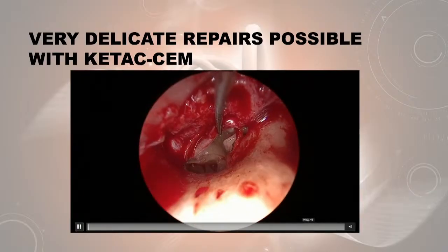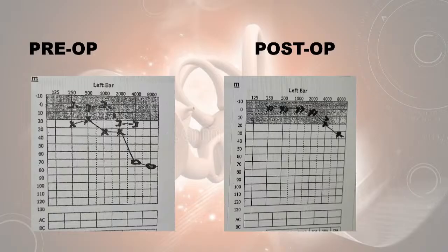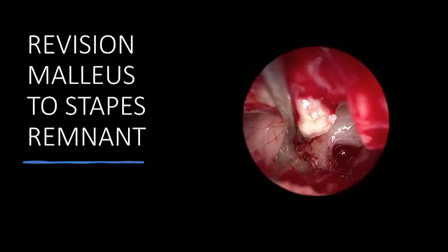And a very nice closure of the air-bone gap. This was not done too long ago. This is about 2.5 years out, so he hasn't had chance.